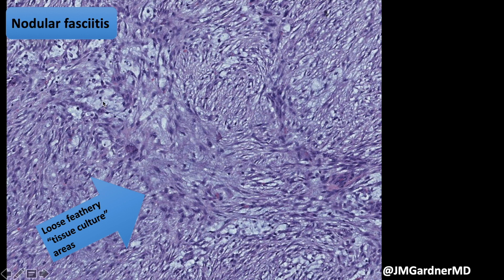Look at the myxoid cystic breakdown — it's subtle, but you can see little myxoid bluish pockets that are breaking down and degenerating, and then these loose feathery areas, or so-called tissue culture areas. Other areas will have little short fascicles of myofibroblasts.